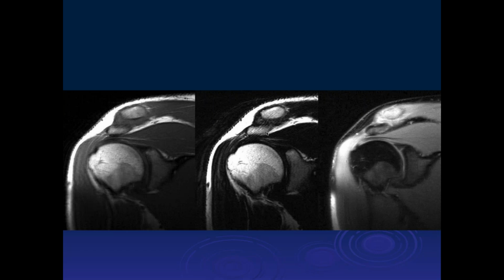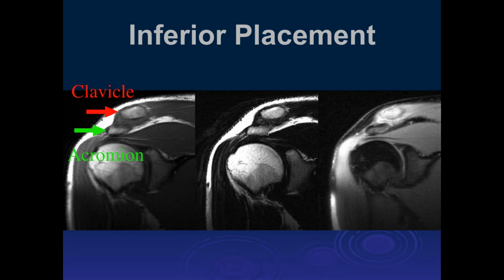Yeah, there are variances from birth, and you see that in kids. So this is congenital. Okay. You would know if it was trauma. Yeah. Good. So this is something I just mention if I see it in the report, if the acromion is inferiorly placed with respect to the distal clavicle.